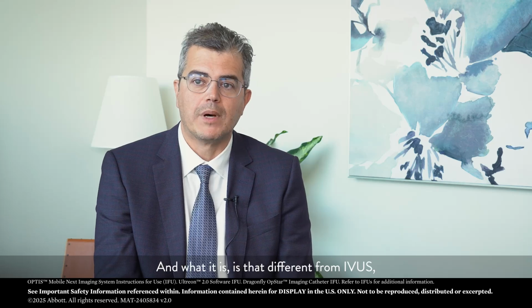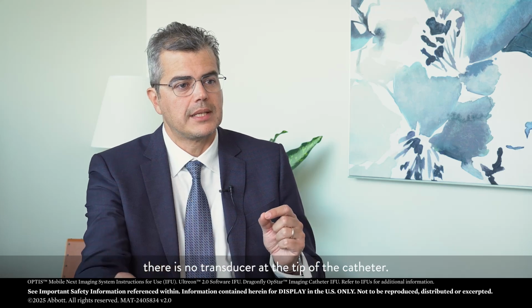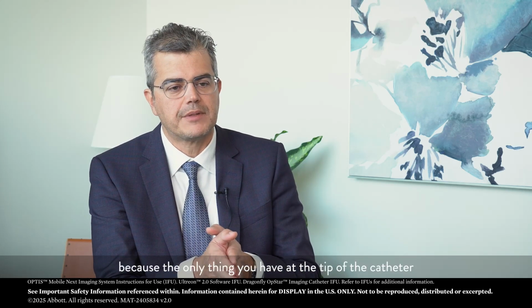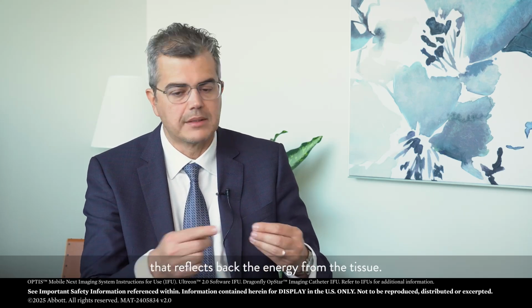What is different from IVUS is that there is no transducer at the tip of the catheter. So it's a very minimalistic design, because the only thing you have at the tip of the catheter is a fiber optic that rotates and a mirror that reflects back the energy from the tissue.